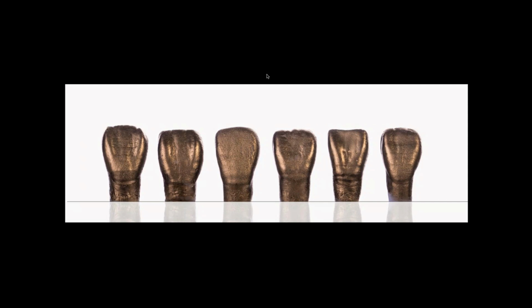First I try to find which shape is the best for my patient. Most of the time, the best shape is the existing shape the patient already has in their mouth. So I always try to mimic that shape, but a little bit better, a little bit nicer, or a little bit bigger, or something like that.